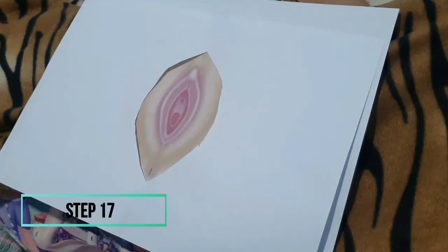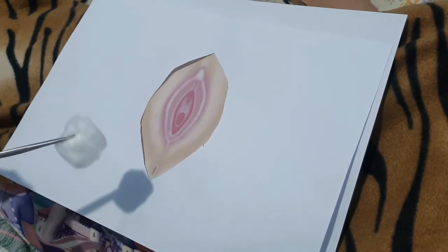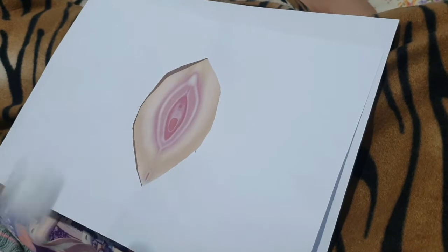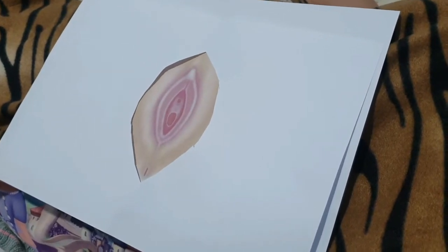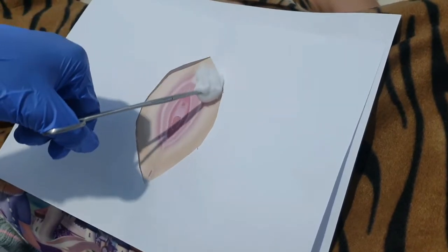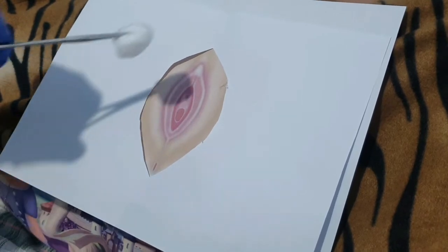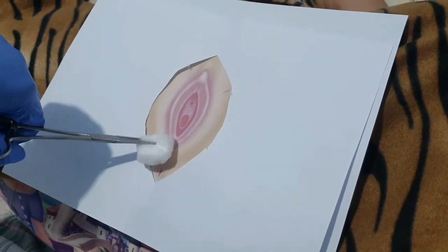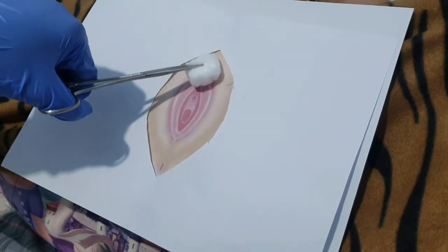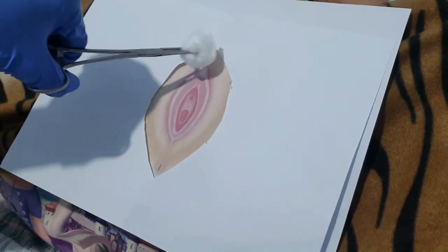Clean the perineal area as follows. We're going to start straight from the clitoris to the anus. Next is the labia majora. Then its opposite side. The next is the labia minora. And its opposite side.